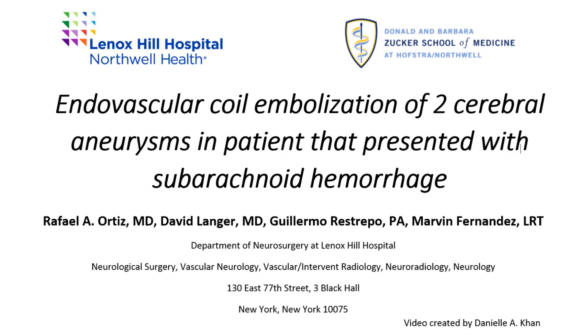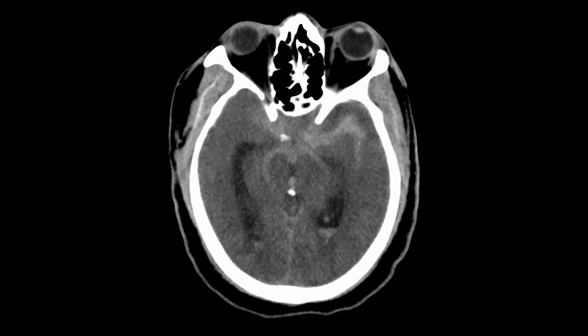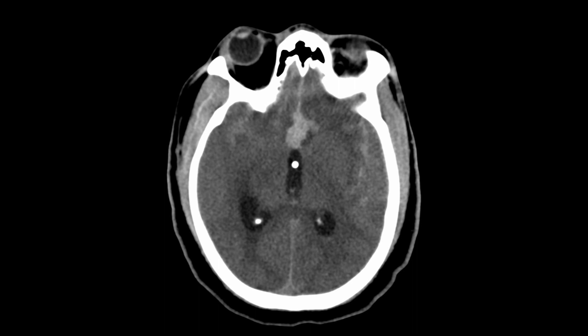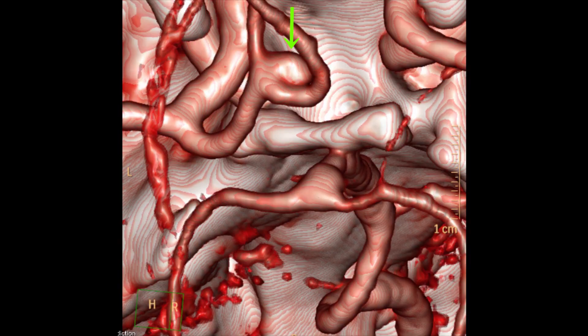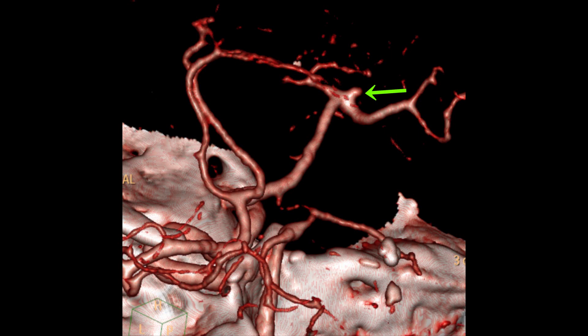This is the case of a 51-year-old man that presented with subarachnoid hemorrhage from a rupture of two cerebral aneurysms. The CAT scan shows diffuse subarachnoid hemorrhage and hydrocephalus, with placement of a ventriculostomy required to lower the intracranial pressure. This is a CTA — a CAT scan with contrast — demonstrating an aneurysm of the anterior communicating complex and a smaller aneurysm of the right middle cerebral artery bifurcation.